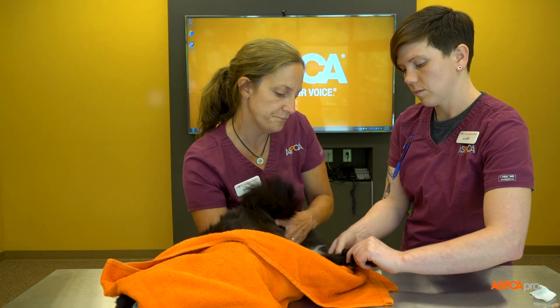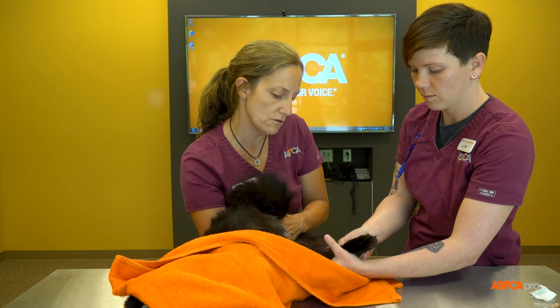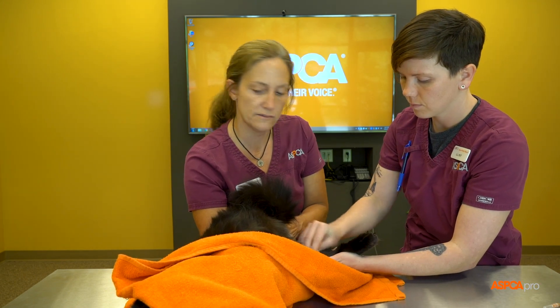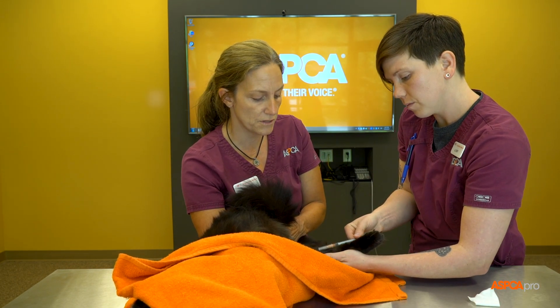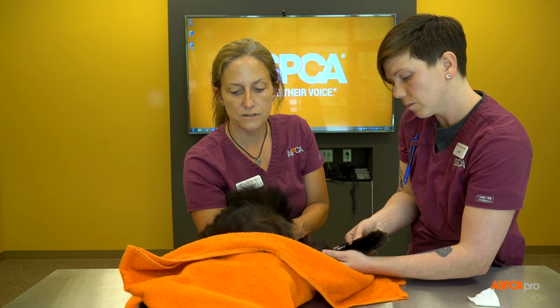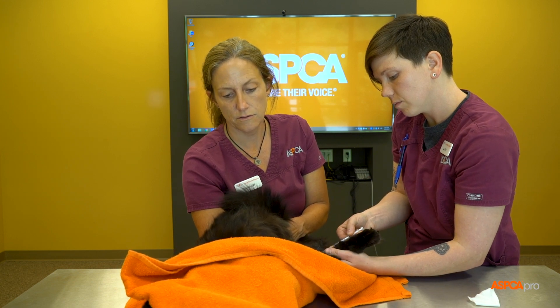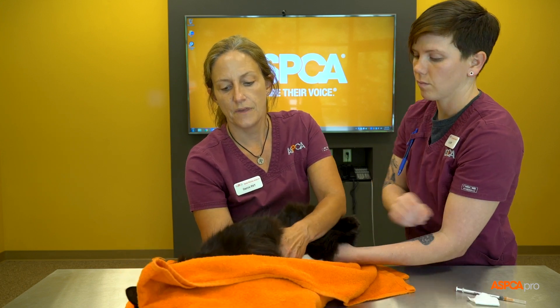LJ can get in through all this fur and belly fat and access the back leg to draw blood. The cover over her head cuts off visual stimulation, and if she decides to paw, the blanket helps with that as well.